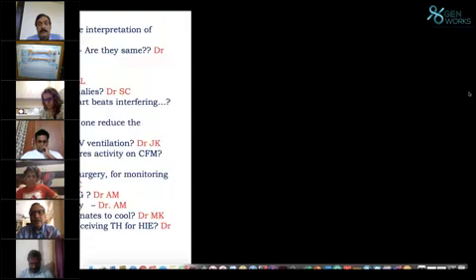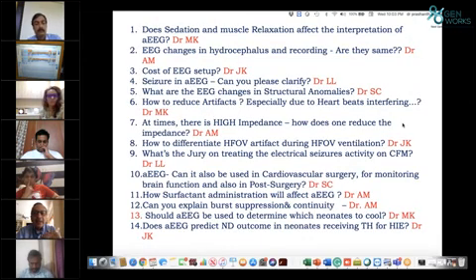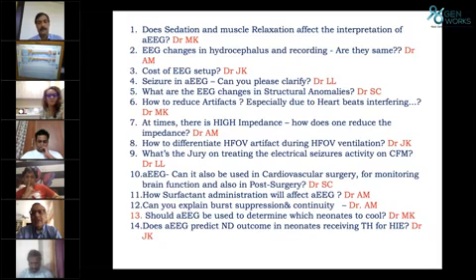Using that Nuprep and the gel, and using a Q-tip or some sort of cotton tip swab to clean the skin, wiping it dry, and then putting the leads on. And then during the recording, sometimes your impedance will get high, and what happens is the gel starts to dry. You can put a drop of water or saline there. Actually, water is preferred to get the contact going again.